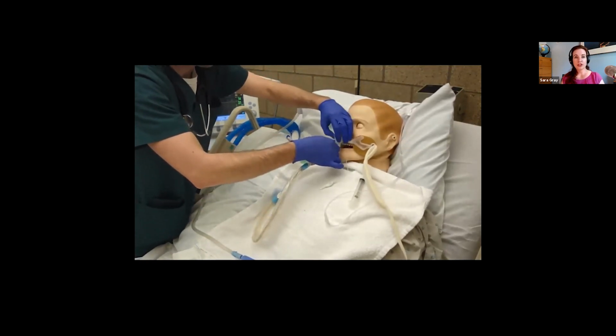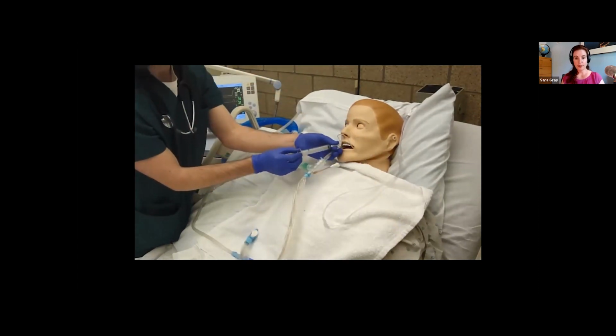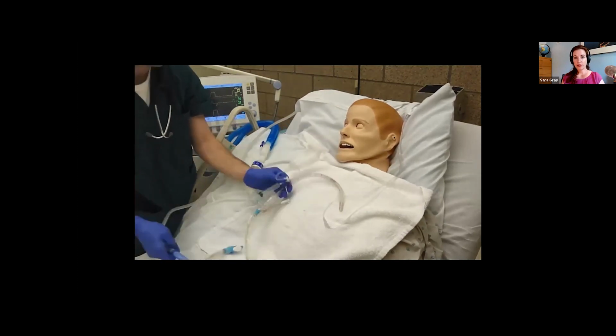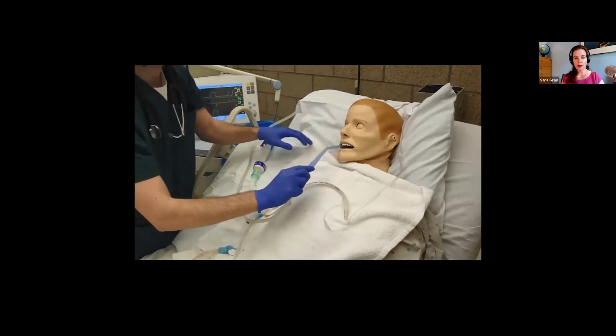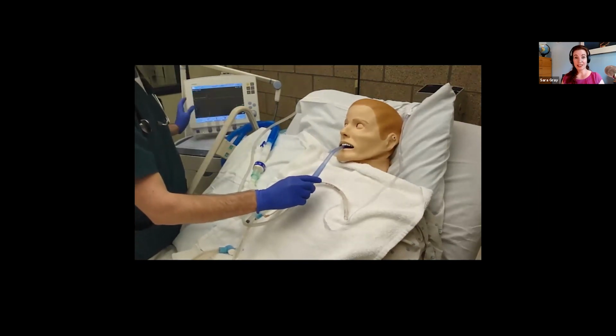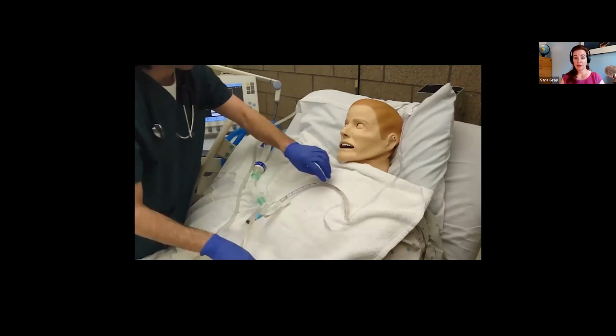And then you're going to attach a 10 cc syringe to the balloon. Coach your patient to take a deep breath in and hold it. Deflate the balloon, pull it out. Encourage them to cough while you suction out their mouth, and you're putting them on some oxygen. That is really it. It is a very straightforward procedure and well within our skill set.